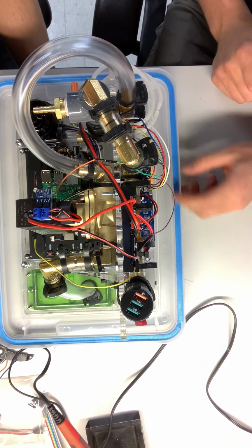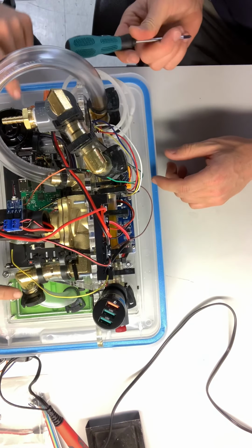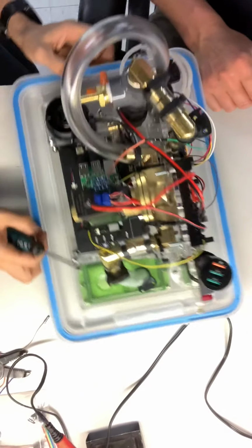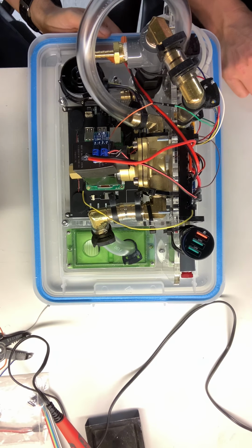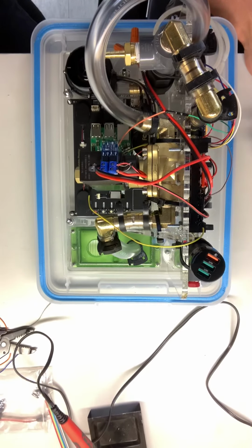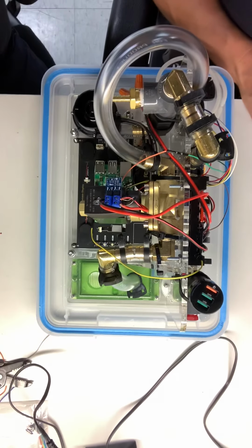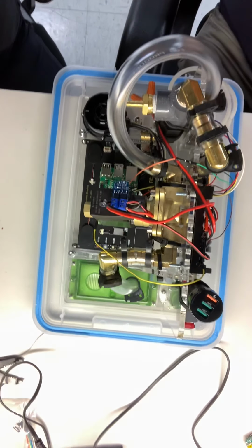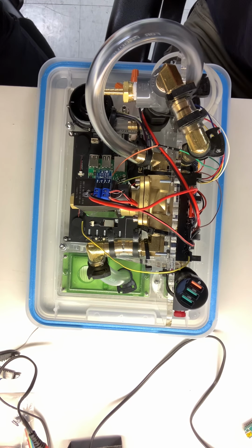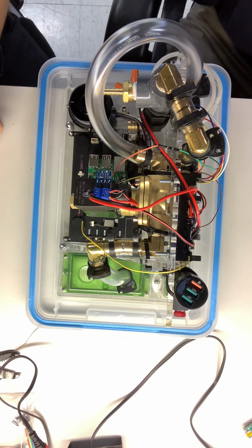That's it. Do you want to talk through the piping? Sure. We don't have this. So starting from the patient, I think it's visible. It's just we don't see it yet. You could have it come out a little more and then just leave this box on it. I can also direct at this point. Do you have a weight that's not heavy enough? Just direct. There you go. No, I think the static camera is better. Wow, this video's already 9 minutes. Yeah. I got it.